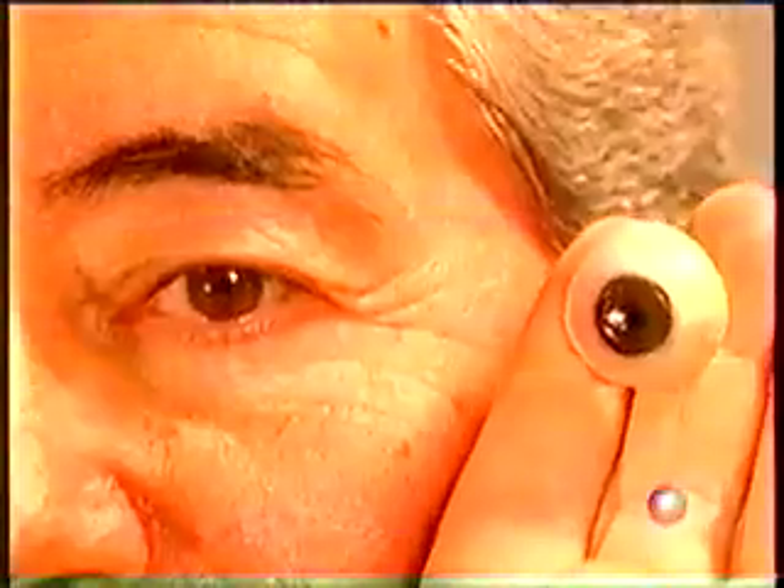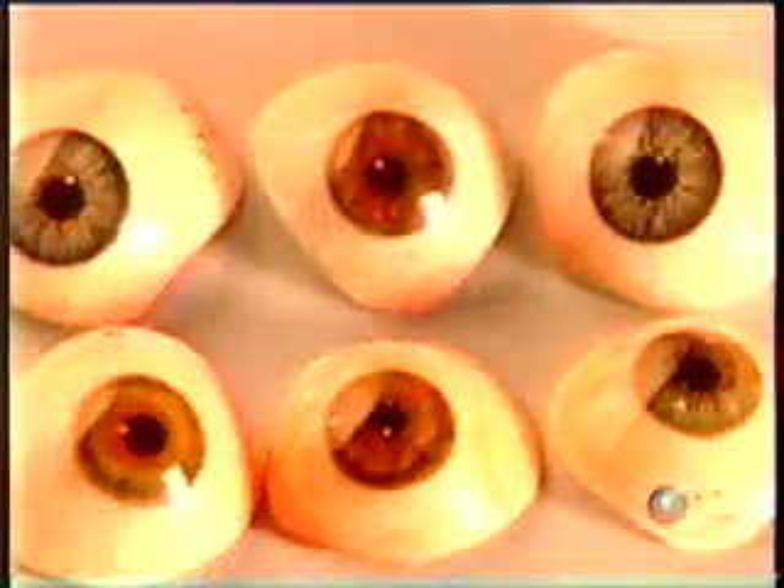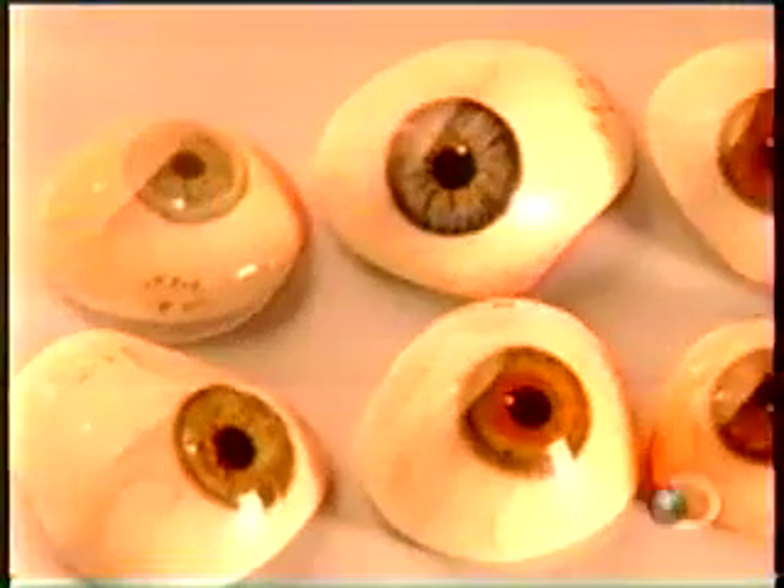Once they're satisfied the artificial eye is a perfect match, they seal the artwork with another acrylic coating. Once that cures, they polish the eye to a shine with a cotton wheel. The shapes and colors of artificial eyes are endless because patients' eye sockets and irises vary greatly, as do their sclerus, the white of the eye.